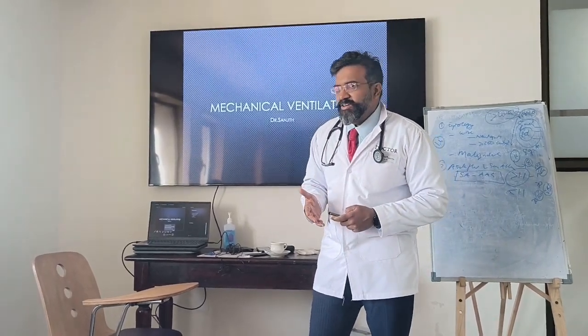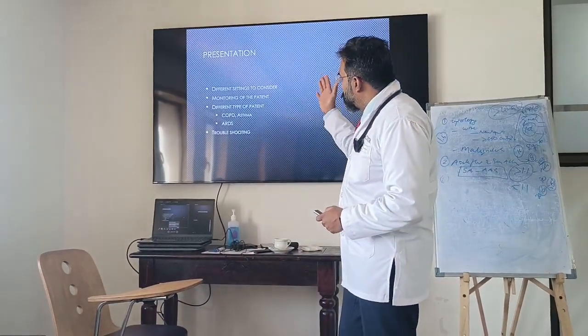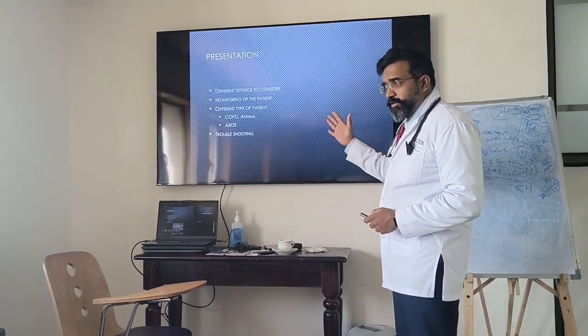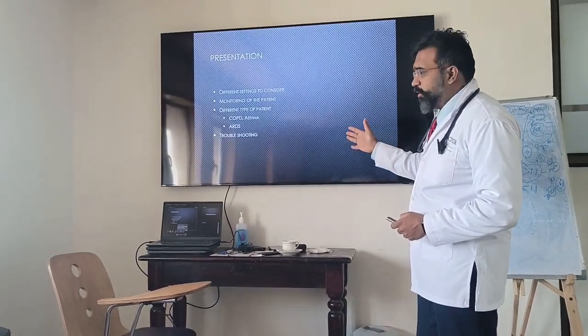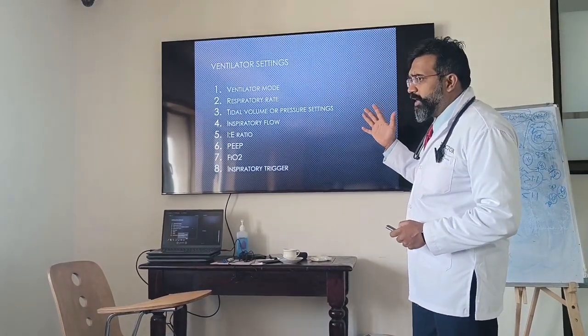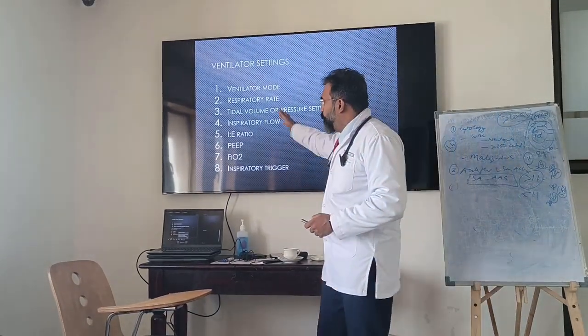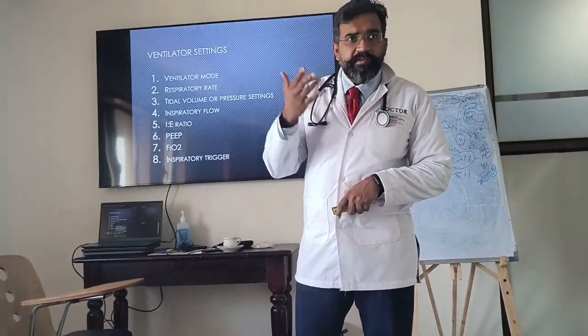Okay, so I'm surprised we didn't do this. We should have done this a while ago. What you must understand is there are different settings to consider. How you monitor your patients, there are different types of patients, and troubleshooting. We go through all these things. Okay, ventilator settings. Whenever we talk about ventilator, we talk about FiO2, we talk about mode, we talk about respiratory rate.